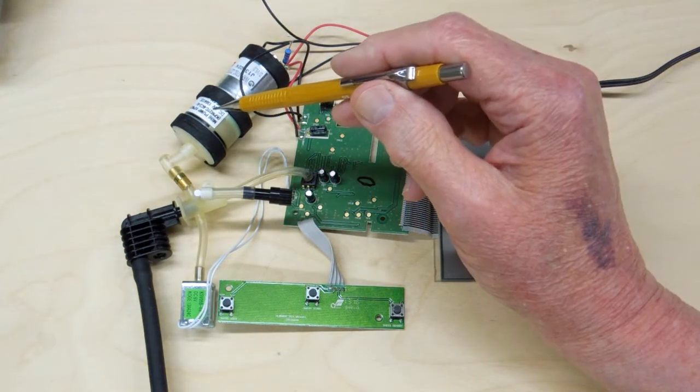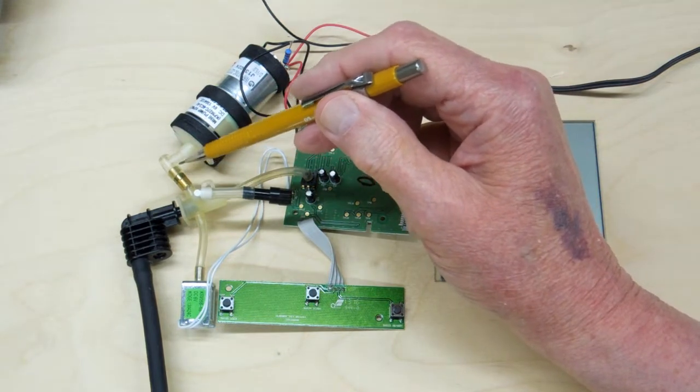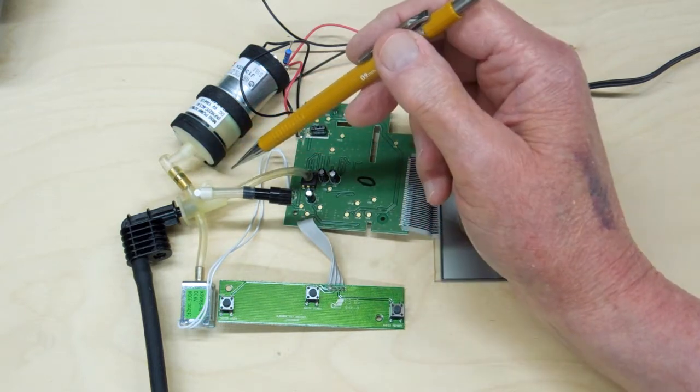The air pump runs like crazy if it doesn't have this little orifice in here. That orifice puts back pressure on the pump to get a more even air supply to the pressure cuff.